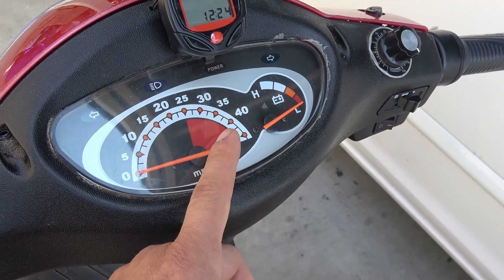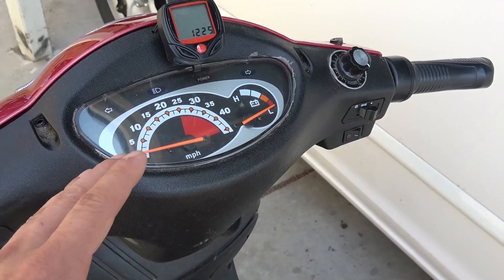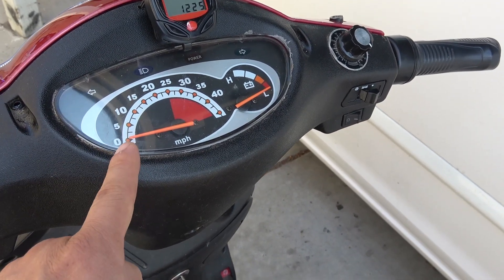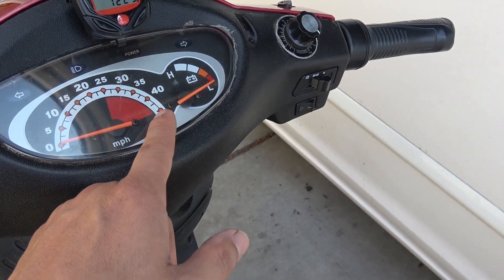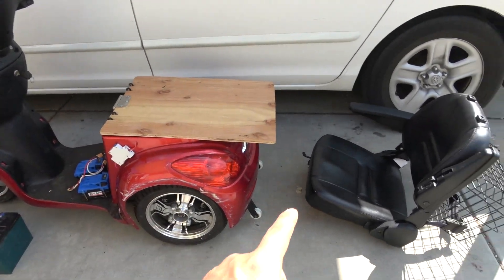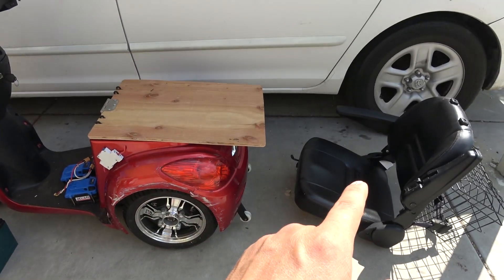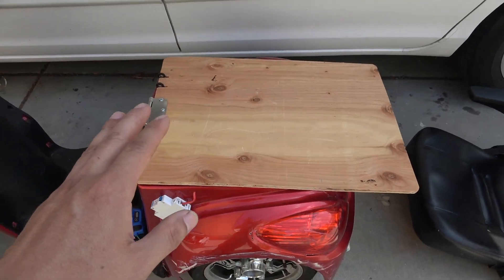Let me show you one funny thing about this scooter — take a look at this speedometer: maximum speed 45 miles per hour. This scooter is made for disabled people mostly, so I don't see the reason why you'd need to drive at 45 miles per hour. I've done some mods to the scooter — I have removed the original seat since it's heavy and I don't need it anymore.